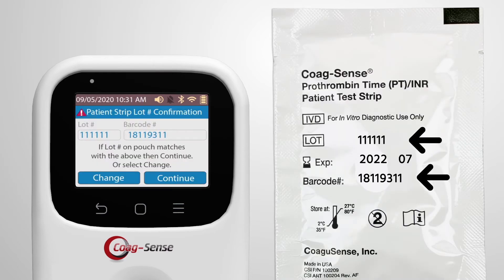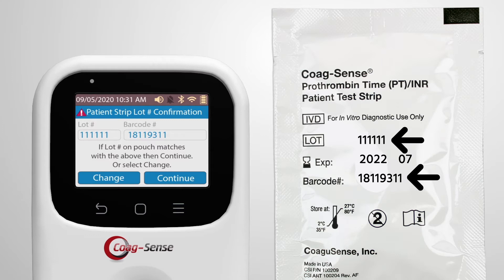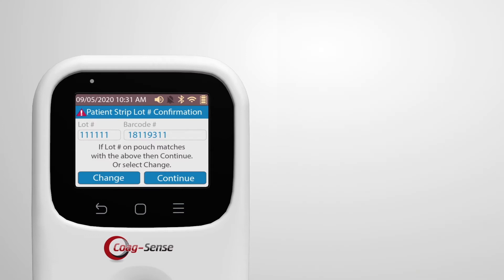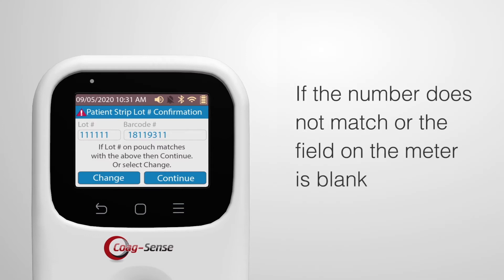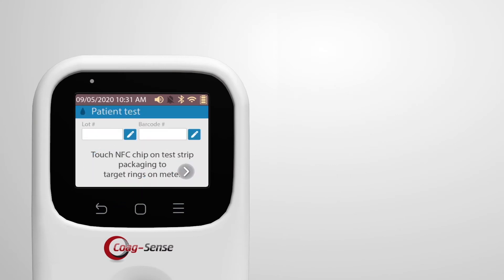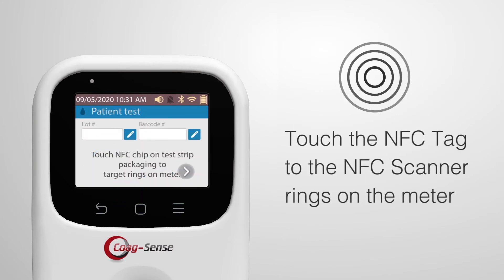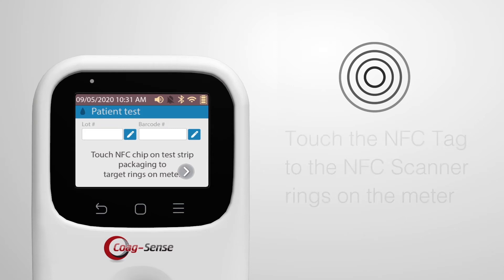Confirm that the patient strip lot number and barcode number display matches the information on the test strip pouch. If the number does not match or the field on the meter is blank, then touch NFC tag to the NFC scanner on the meter.